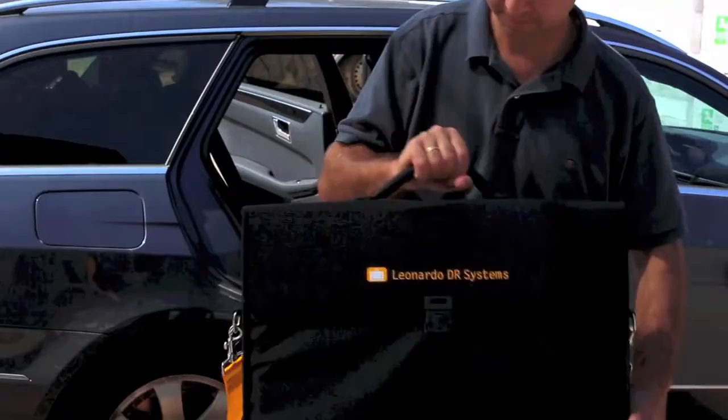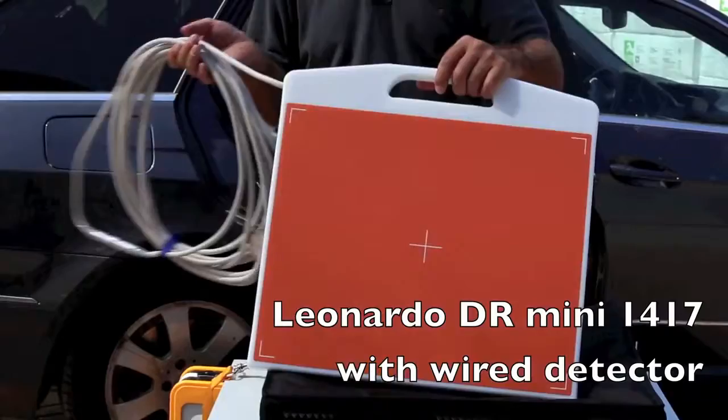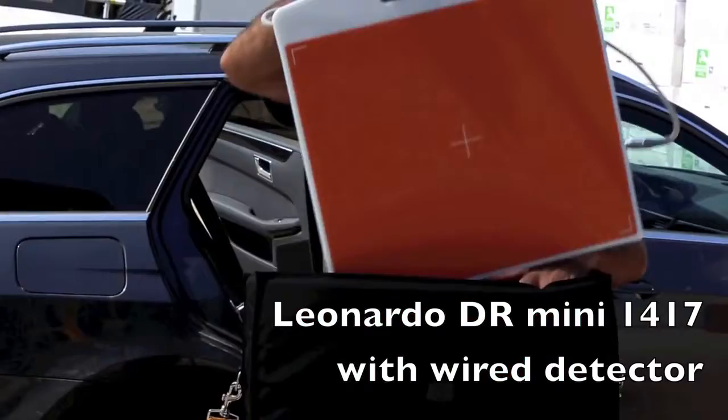For x-ray examinations requiring a larger detector area, for example for mixed veterinarian practices with small animal clinics, both wireless and wired detectors with an imaging area of 35 by 43 centimeters are available. The large detector can be carried in a practical transport bag for outpatient use.